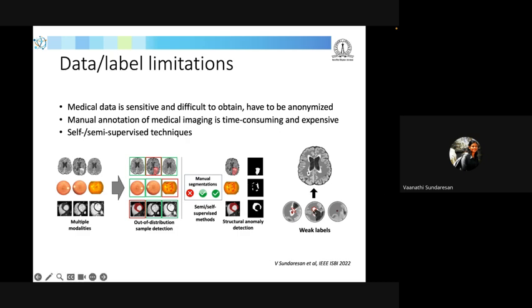So they do very basic scribbles, or they just put a circle indicating that this is the structure you want to detect, and they don't cover the whole area of the disease sign, just part of it. Or they even put a dot, because for very small lesions they cannot zoom in and mark the whole lesion boundary, so they put a dot saying that this is the lesion you want to detect. Right. So how do we handle the lesion detection process if that is the case?